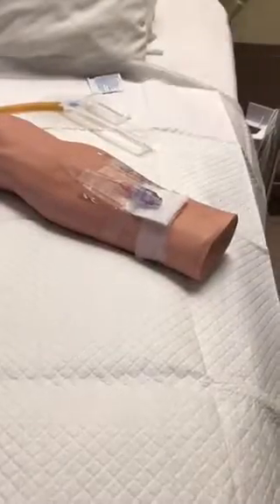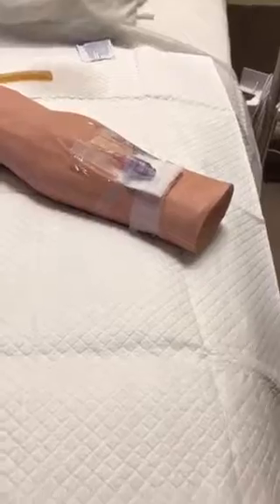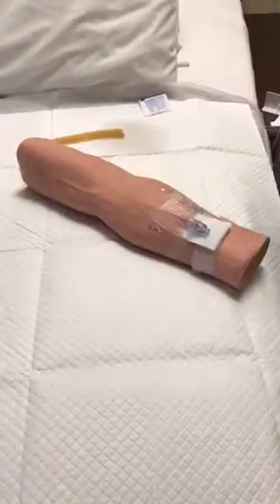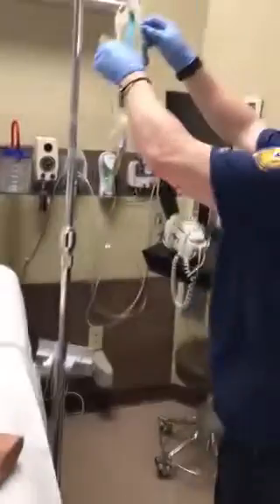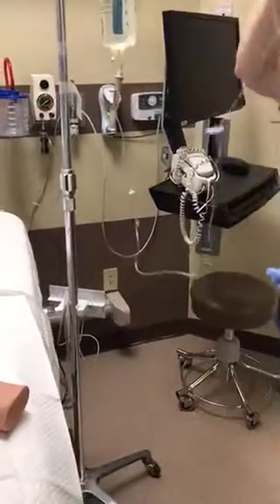Alright, so let me go ahead and clean this site up here. Oh, I'll grab that in a second. Get my tourniquet and throw it in the garbage. And I'm going to walk my sharps over to the sharps container. Back. And I'm going to go ahead and set up our IV solution on here.